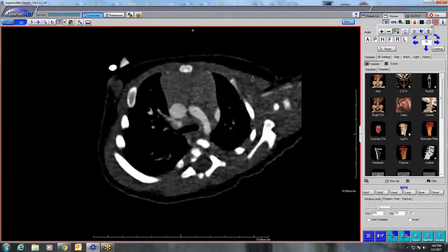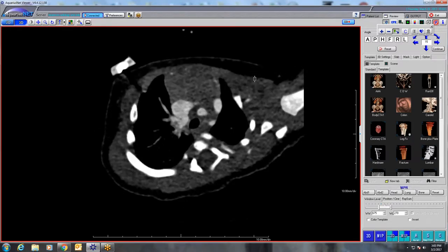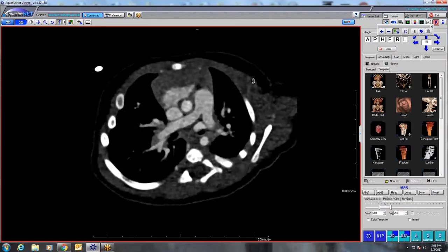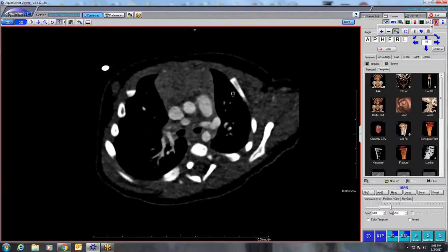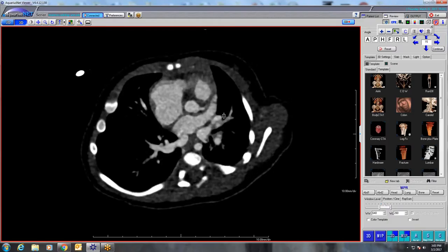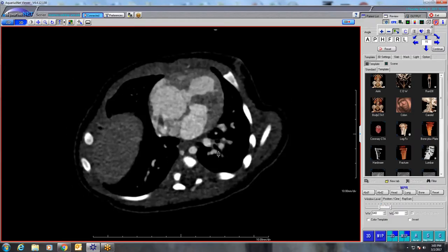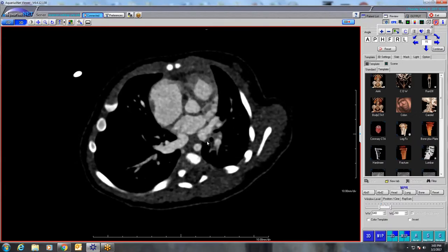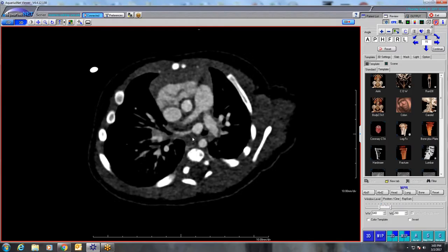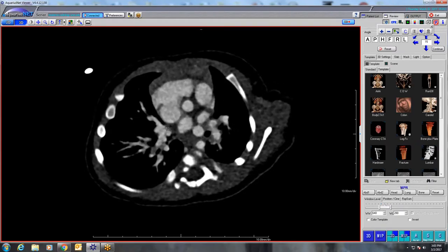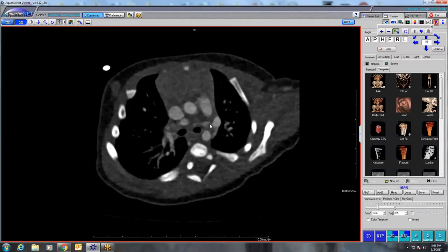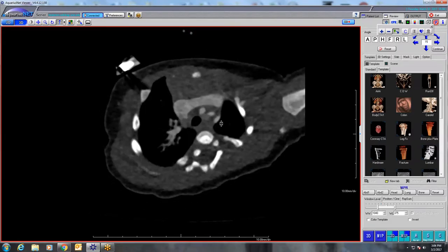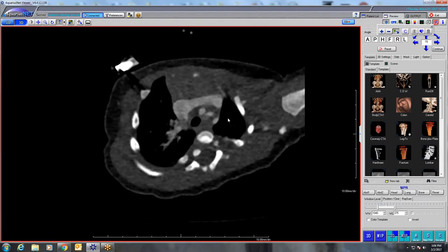A couple of cases. This one happened when I was out of town — a very interesting case. We can see this strange vein here, and if you follow it down, all of the left pulmonary veins connect to this structure. Additionally, there's an accessory right middle lobe pulmonary vein connecting to the structure that then goes up and drains into the brachiocephalic vein. So that's kind of an extra-cardiac partial anomalous pulmonary venous return.